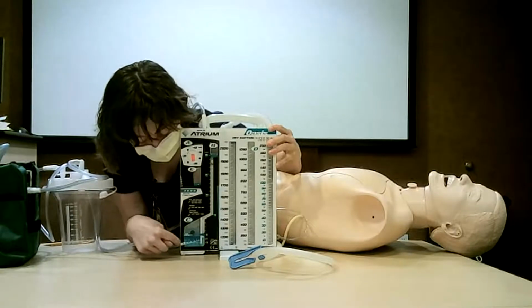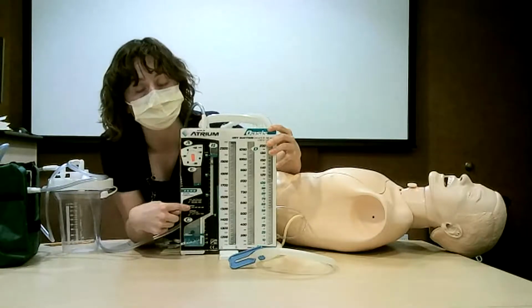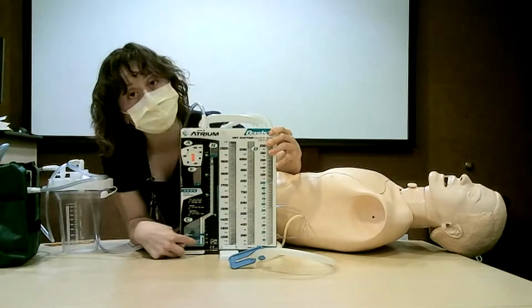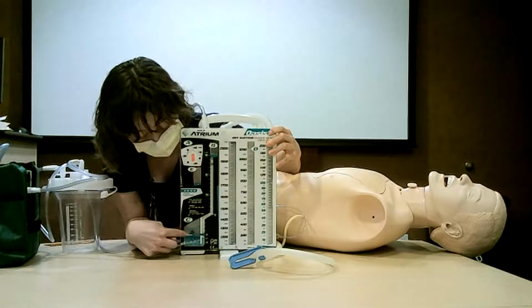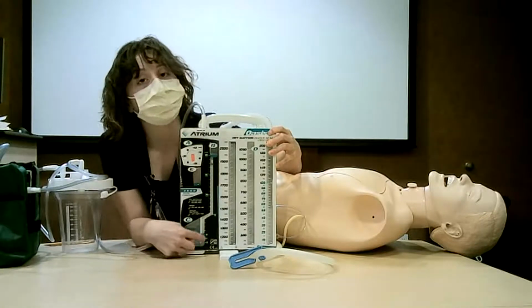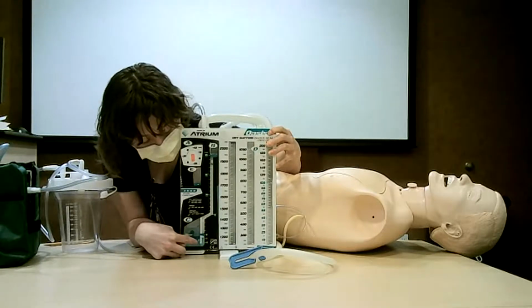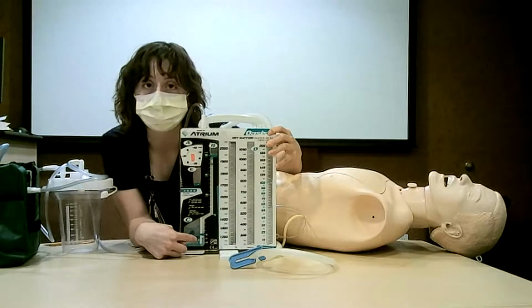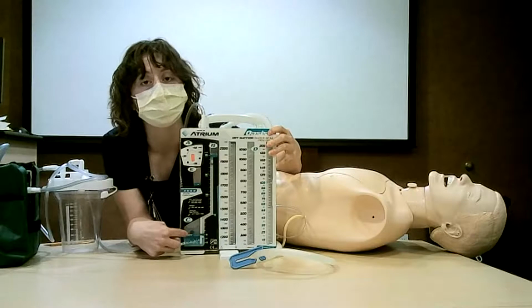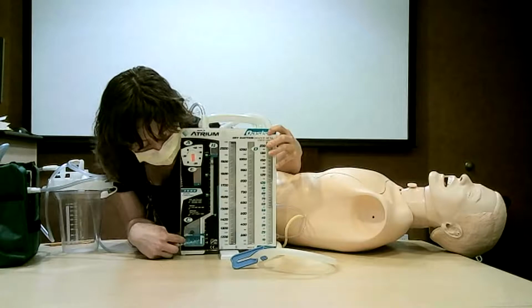A few other areas you're going to want to assess on the atrium itself is down here. This is where we will look for air leak and tidaling. An air leak is a bubble that will travel completely from one side of this area to the other. It's a continuous air leak if that's happening continuously. You may also want to instruct the patient to either talk or cough or move around a little bit, which can stimulate an air leak as well, and we consider that an intermittent air leak if it's based off of what the patient is doing.